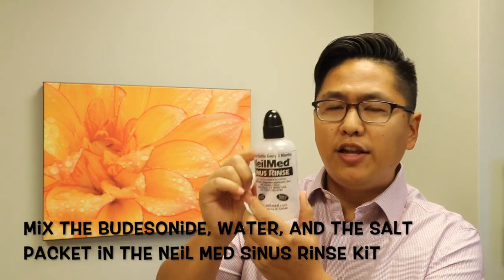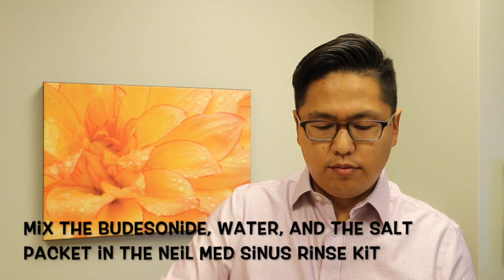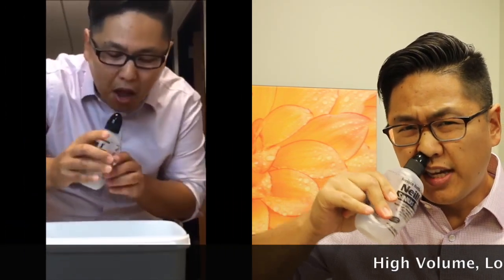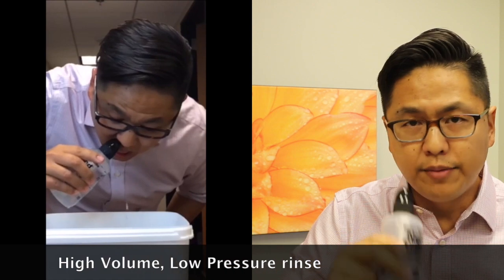Fill it to the dotted line with barely warm water. Put your finger on top and mix it about. Then place it just underneath your nostril and gently squeeze. Switch between the nostrils until the water is all gone. You'll want to do this over a sink, or the water will go all over the floor.